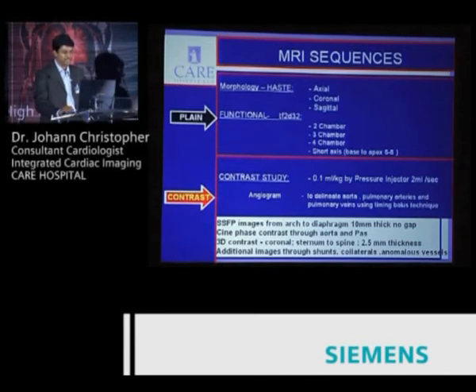Pulmonary venous anomalies also are very well picked up with MR, and it's important in the contrast study that we do at least 2 or 3 sequences, the arterial sequence immediately, once injected with a 5 or 6 second delay, and we inject them, we also image them at least twice, and for patients with Fontan we do even a delayed sort of scanning to see the slow venous return in a Fontan. So these are some of the extra things on the console that you have to be aware of, apart from the standard sequences.